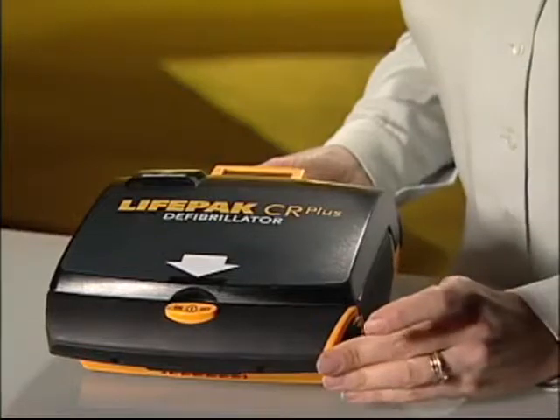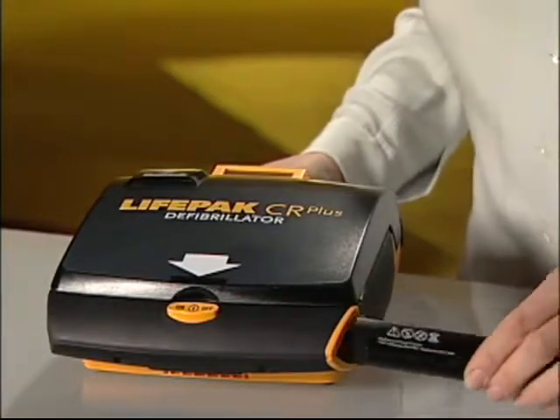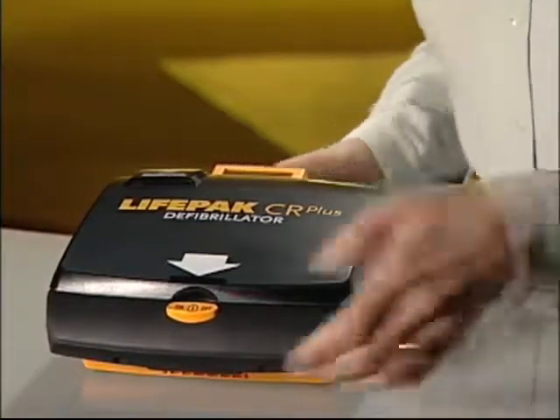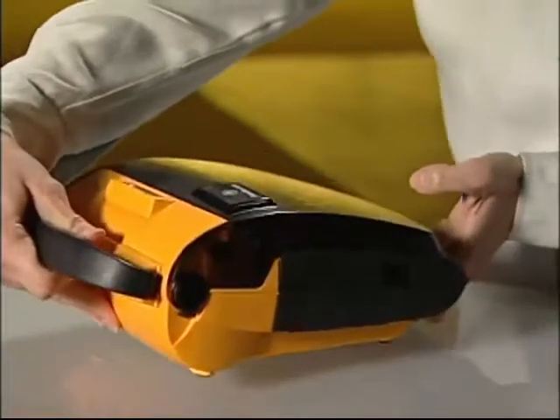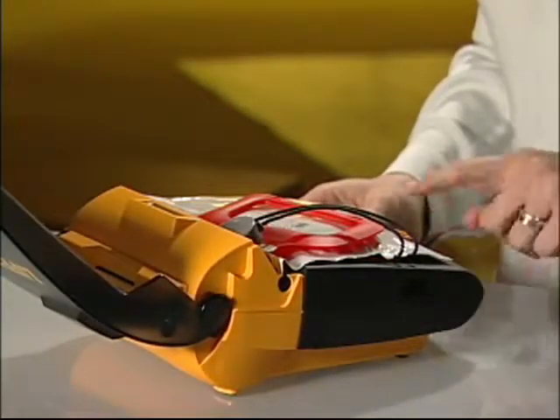Squeeze this little latch and slide the old one out. Then slide the new one in until it clicks. Replacing the electrode packet is also easy. Open the lid. Call for help now.